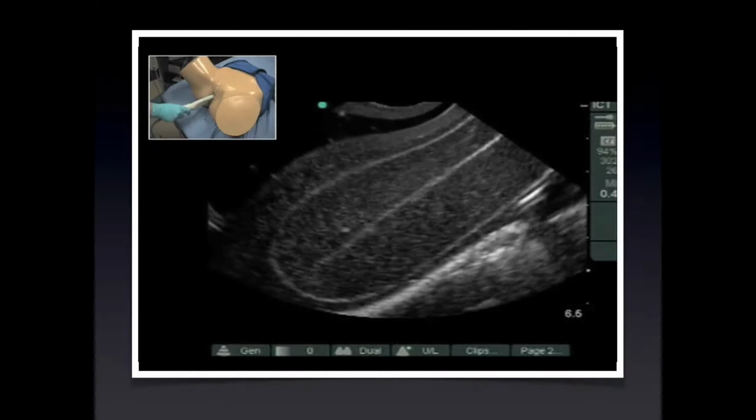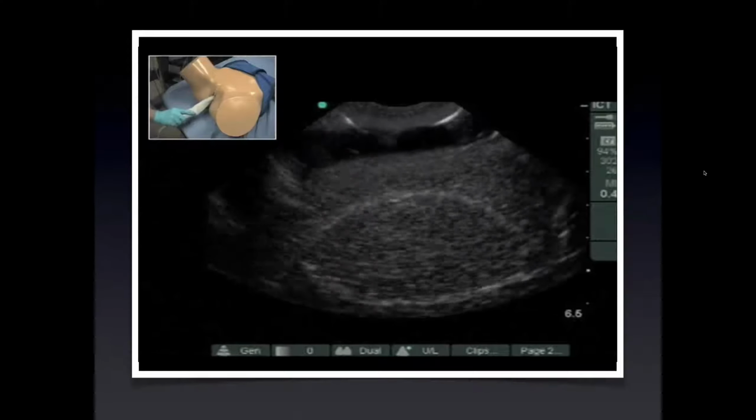Once we've identified the uterus reliably, we're going to fan completely through the uterus from side to side, defining its transverse margins like this. We fan, as with any organ, until the organ comes completely in and out of view. This is a complete sweep of the uterus. Next, we'll switch planes into coronal view by rotating the indicator to the patient's right side, and then we sweep completely up and down as you see in this video, again sweeping through the entire uterus.